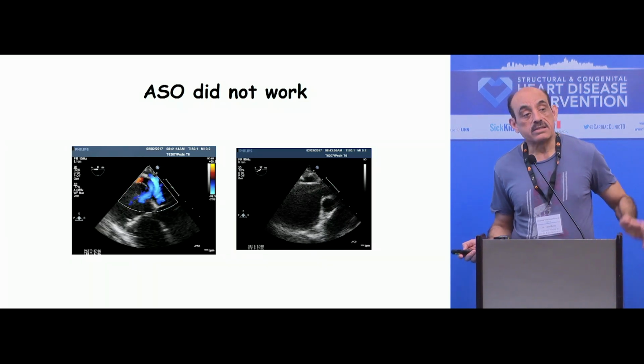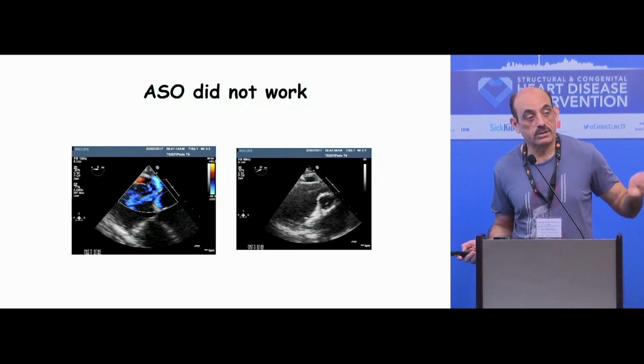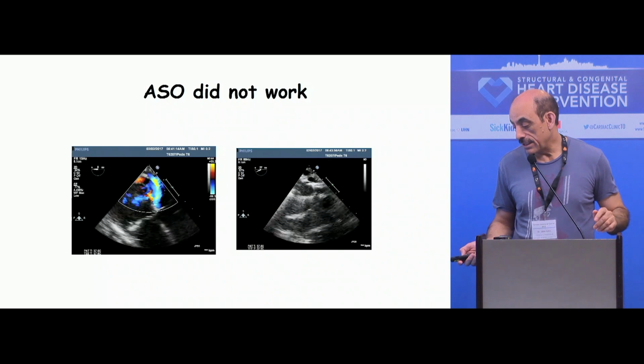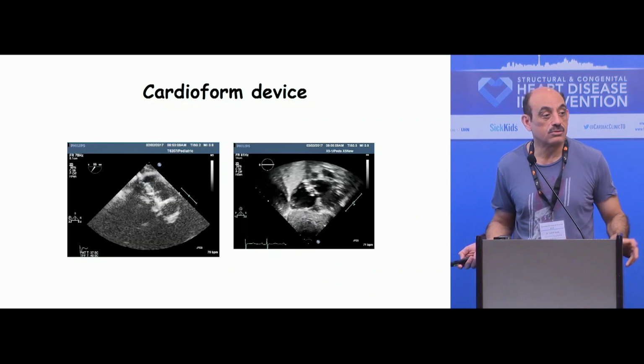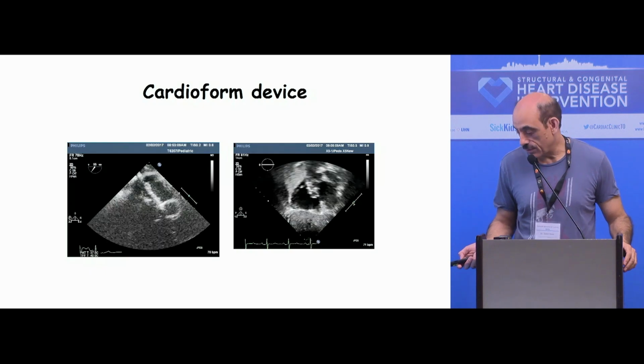We tried to put in an ASD device. I spent maybe 45 minutes trying to put the device. It absolutely popped out, or it looked so ugly that I didn't want to leave it. So then I put in a Cardioform device, the largest they made. It stayed there for about 2 minutes, still attached, but it popped out. So anyway, we were still attached to it, so we took it out.